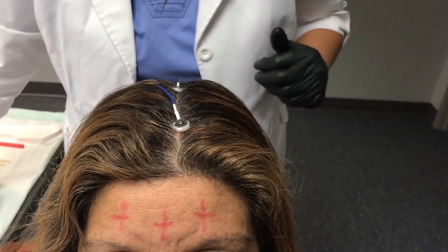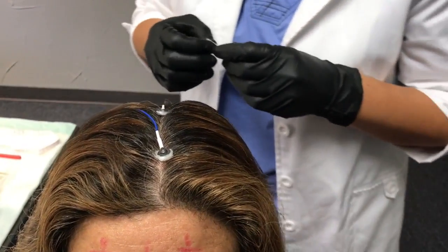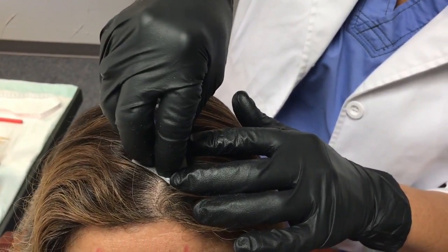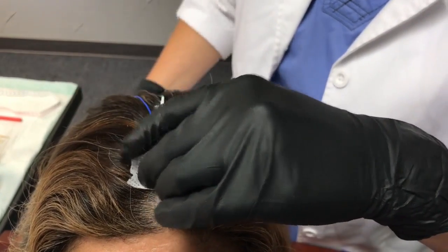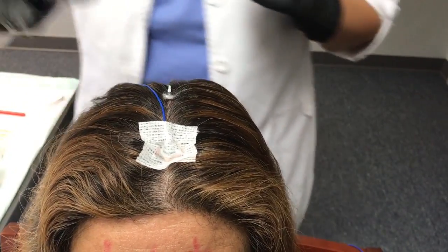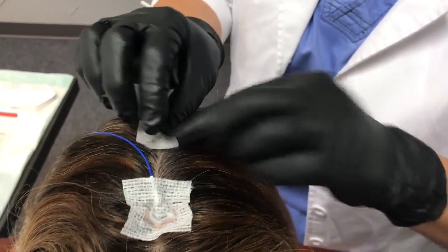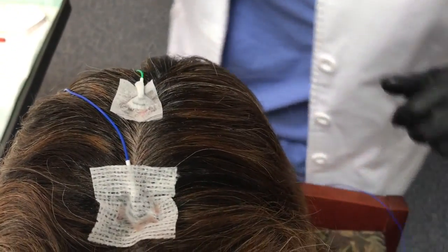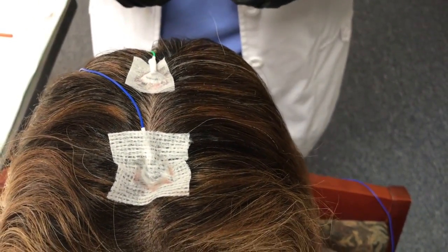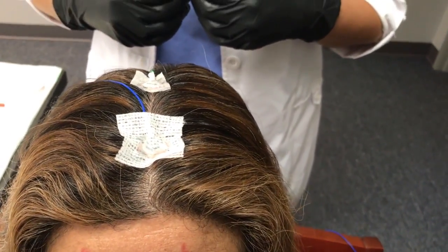Do not worry if some of the paste comes out from the top of the EEG cup. Next, we're going to apply a pre-cut gauze square or a piece of paper tape over the cup of the electrode. You'll want to press down gently to secure it. When you place an electrode, make sure that its tail is oriented toward the back of the head so that all wires can be easily gathered together in order to make the setup as light and comfortable as possible for the patient.